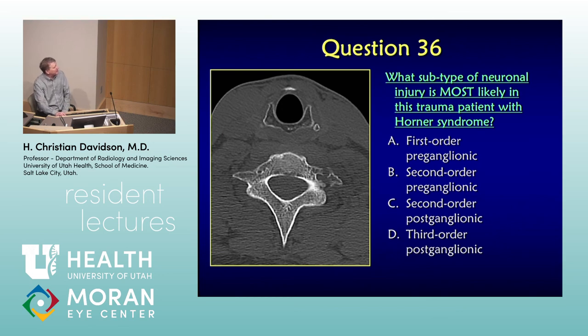Okay, so this is a trauma patient, and they have a fractured transverse process. And by the way, can you recognize the level by the morphology? Said it in the video. What's that? I'll give you a hint. The transverse foramen is this little tiny thing that is not being used. That's why it's tiny. One of the cervical vertebra doesn't have the vertebral arteries in its foramen. It's a vestigial foramen. Which level is that? Seven. So you can actually tell seven by its morphology.